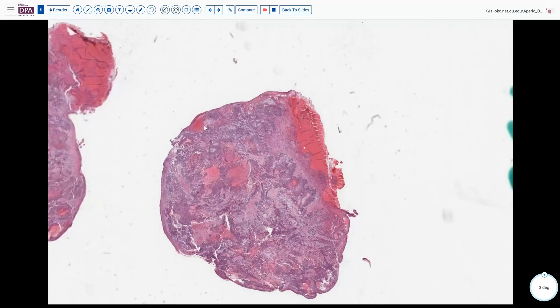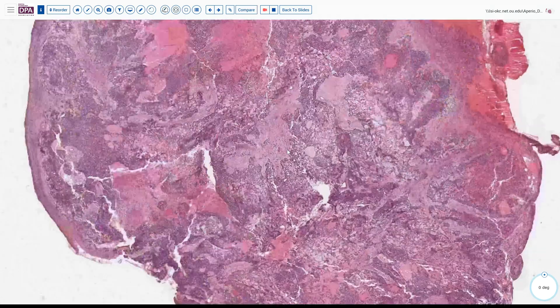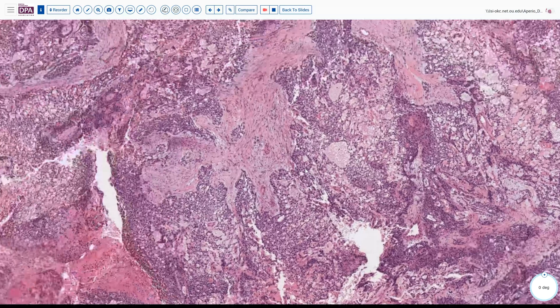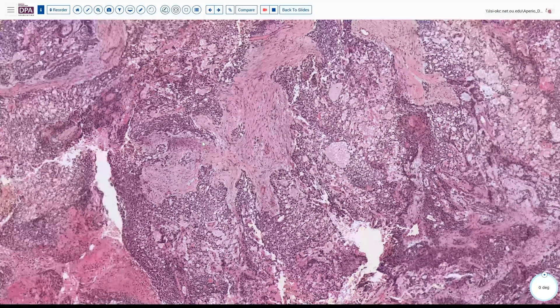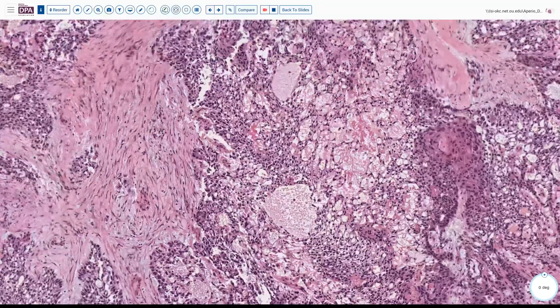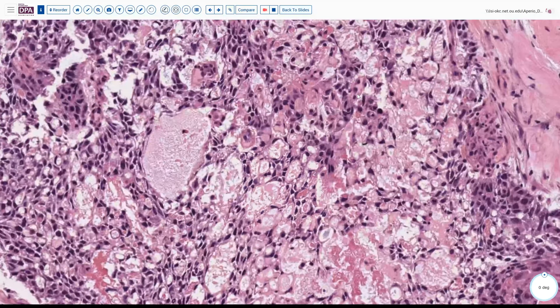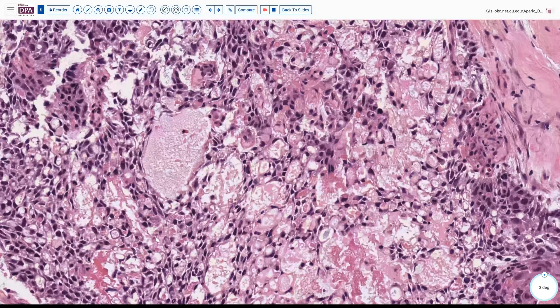The patient also had a bulky ovarian mass. Looking here at the permanent sections from the omental area, we can see more of this pattern — a mixture of solid and lace-like pattern growth — and this sort of appearance. You can see the eosinophilic droplets in some of the cells here as well.